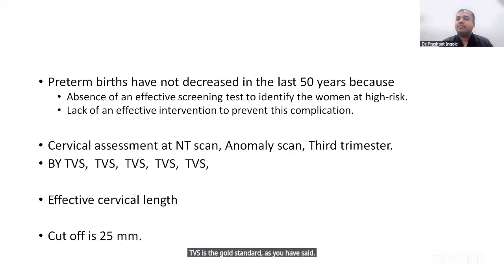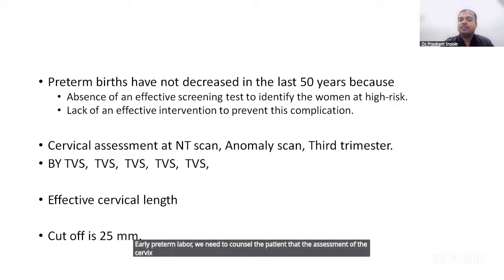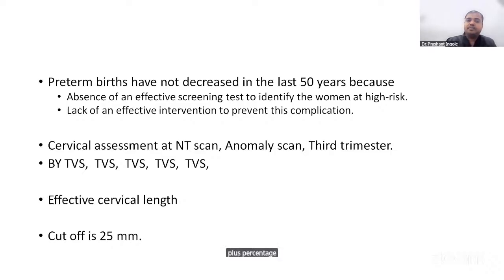Also, patients have got false beliefs. Patients may say that it may cause miscarriage, it may cause abortions, it may cause bleeding PV, or it may cause early preterm labor. We need to counsel the patient that the assessment of the cervix is incomplete without doing a transvaginal scan. And as a clinician, I would only like to know the effective cervical length, or what you can say the functional length of the cervix, plus percentage of funneling if it is there.